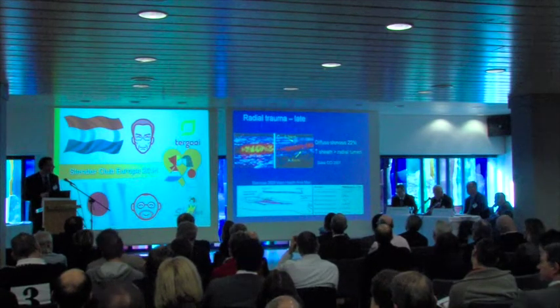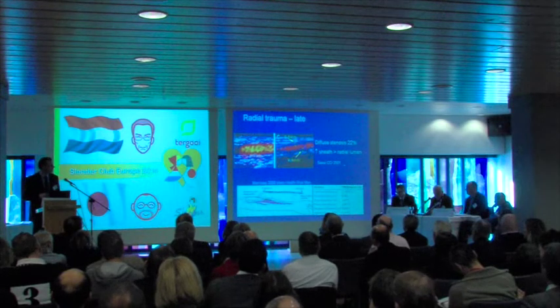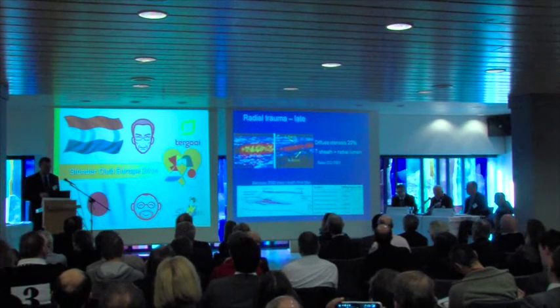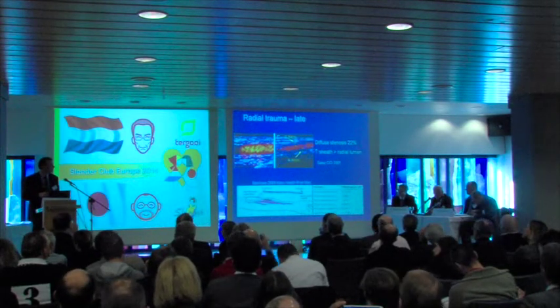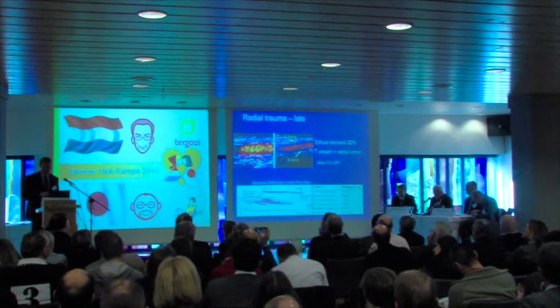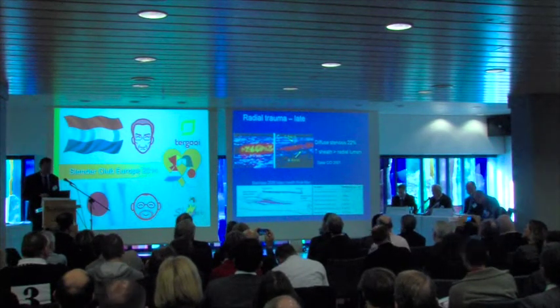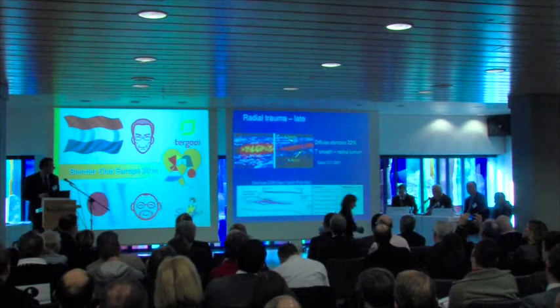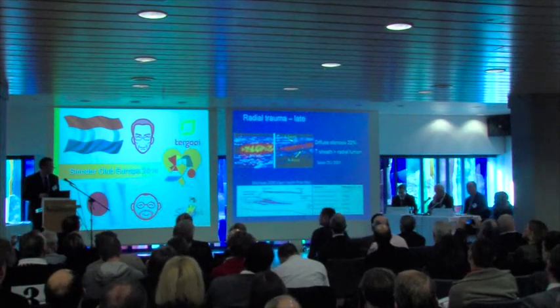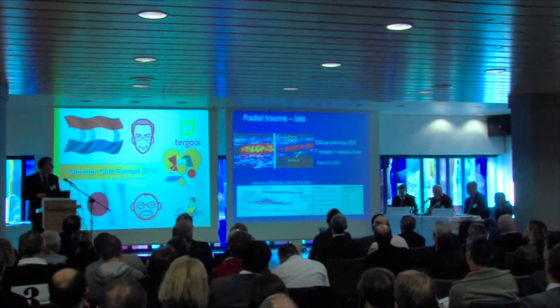This has been shown by other different techniques. So this is an old ultrasound study showing several years ago that the incidence of diffuse stenosis was 22% following radial intervention. And when we take out radial arteries and use them for grafting purposes, you can see here that following radial catheterization, 3/4 of radial arteries had significant intimal proliferation.